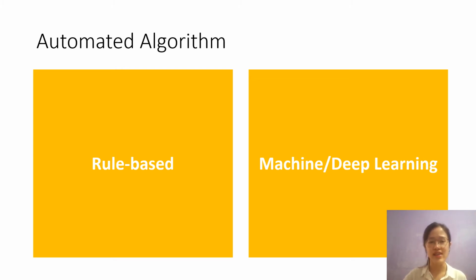Rule-based algorithms, as the name suggests, are done by setting a few rules to filter the waveforms. If certain rules are satisfied, we can recognize it as an asynchrony, and if not, it is a normal breath. Another approach is using artificial intelligence, which is a powerful tool for learning from data. For example, a CNN is capable of learning patterns from the data provided, without anyone telling the computer what the desired patterns are and where it should look for them.